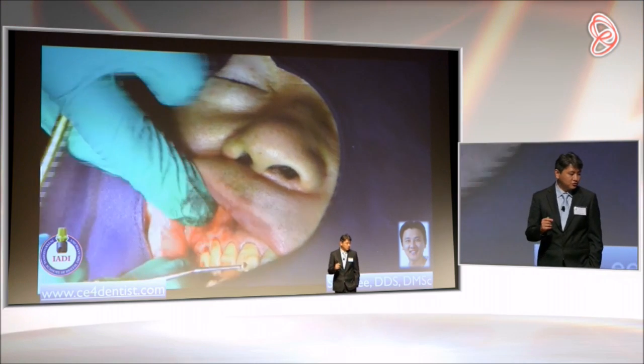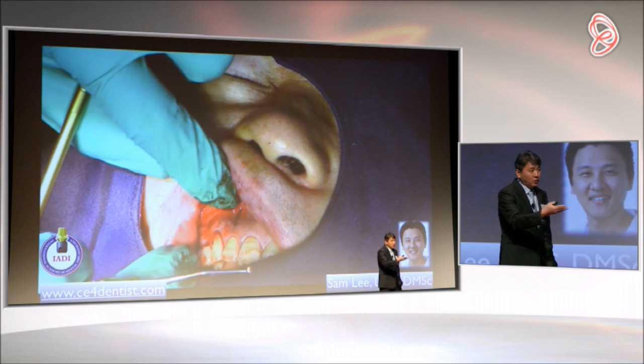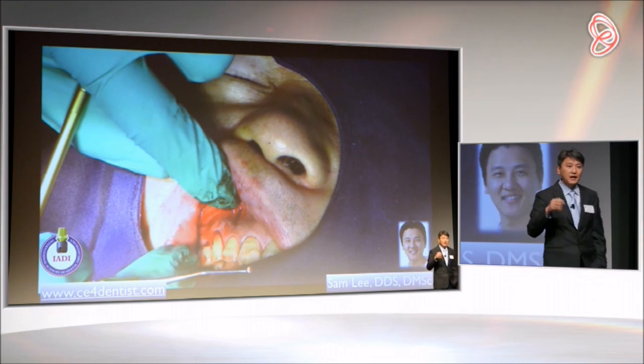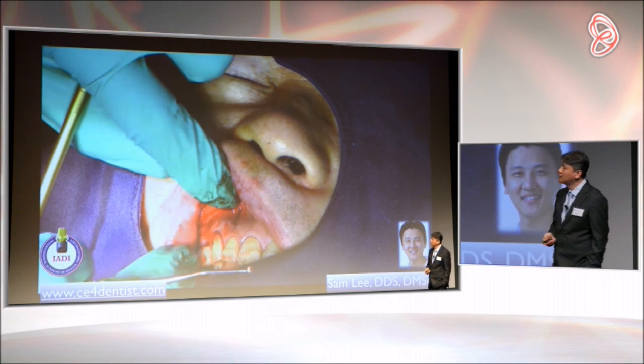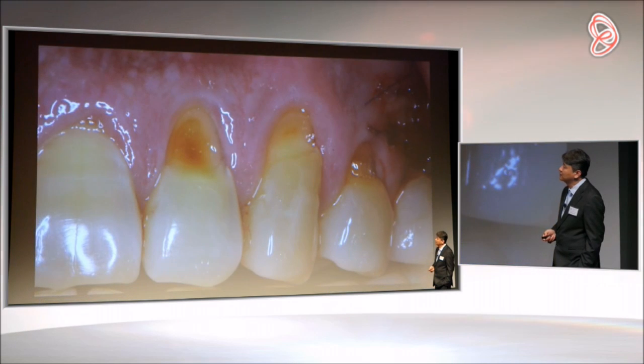So no suturing is necessary. We just position the gum down. If you want to build bone, you can add bone by utilizing decortication with a back action chisel, and then you put a membrane and so on. But for recession, it is not necessary.